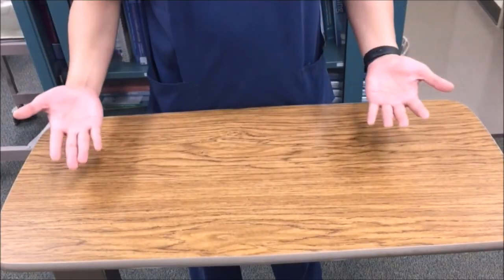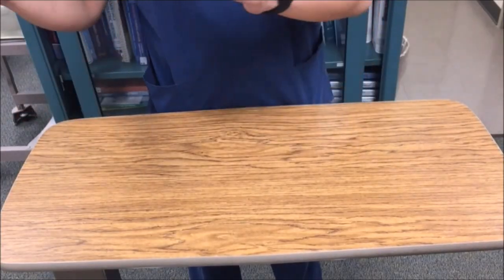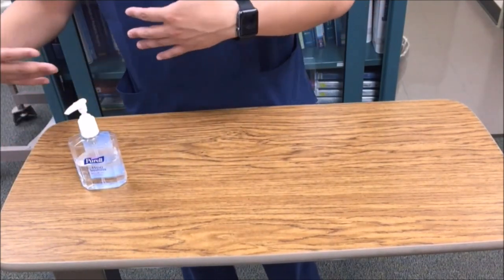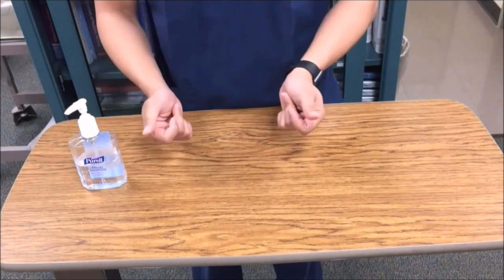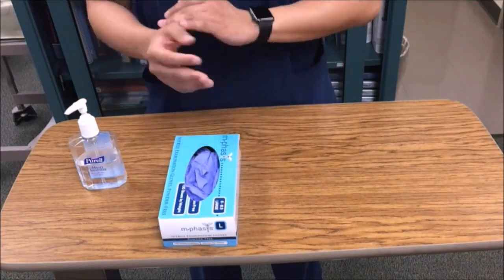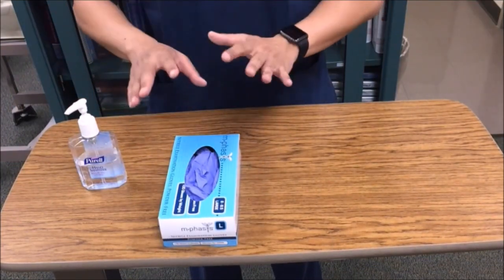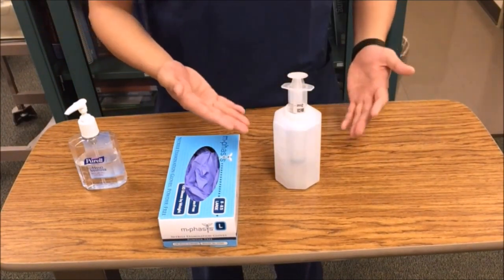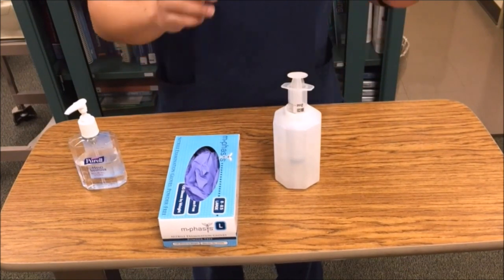The very first thing that we have to do is compare the MAR to the doctor's order. Next, as we're going to gather our equipment, we're going to start with our hand sanitizer to clean our hands, or simply just wash our hands before coming in contact with your patient. Gloves — we need gloves because gastric contents are considered to be body fluids. Syringe — this equipment can be used to check your tube placement, to mix medications, or to flush the tube.